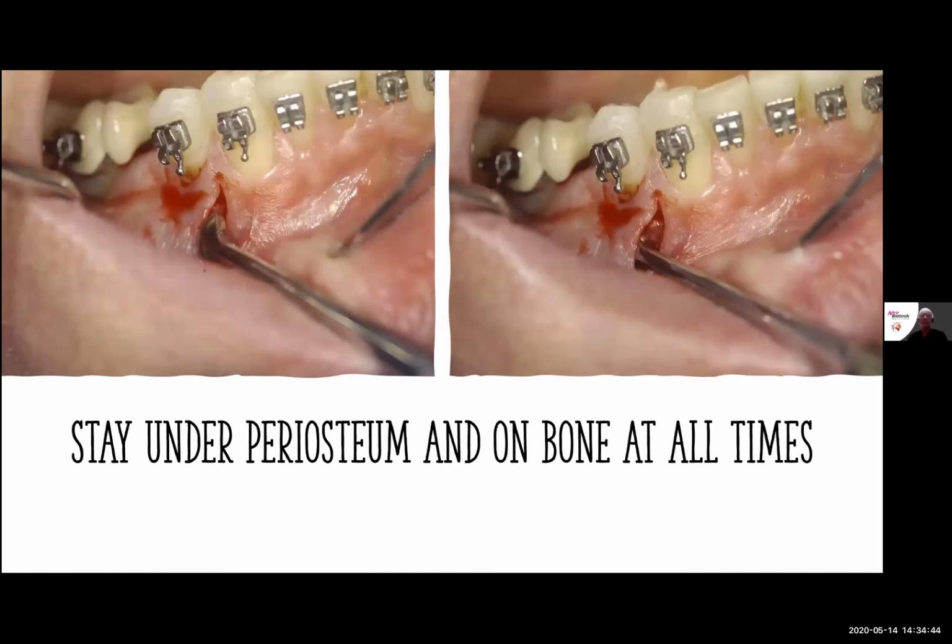As we continue to move on, we need to make sure that the tip of that Molt is staying directly onto bone. We want to be under the periosteum. This is not a split thickness flap that we are making. This is a full thickness flap that we are creating that is going to separate the periosteum from the actual cortical plate itself. That is the goal of this for the entirety of the tunnel itself.